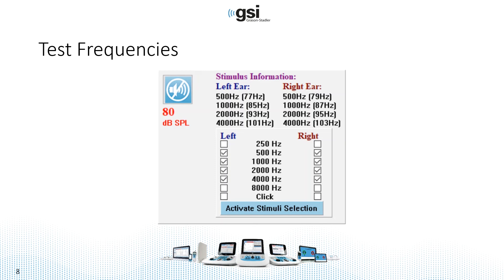which has a modulation rate of 103 Hz. Once you've selected your frequencies, you can select the Activate Stimulus button.